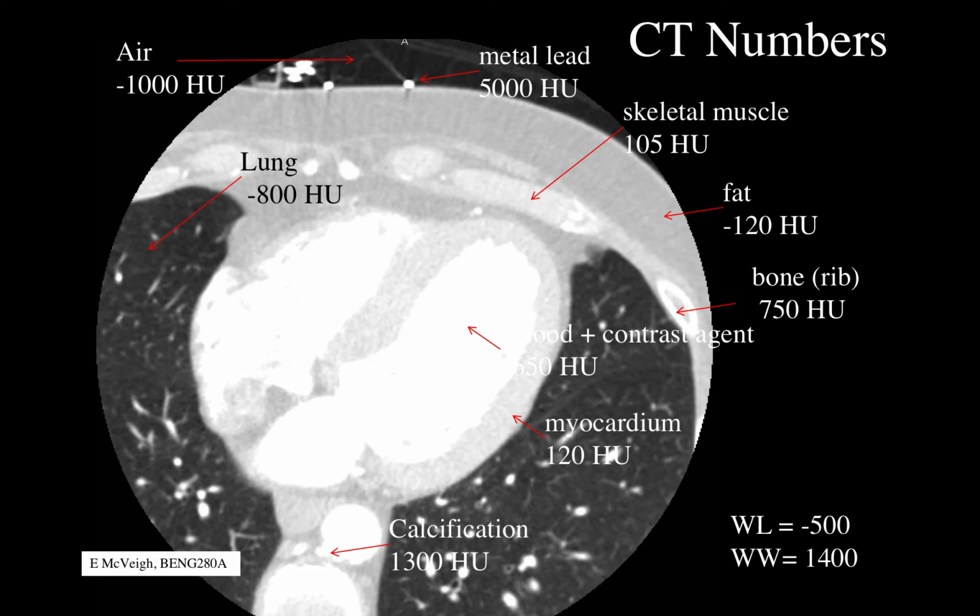Inside that voxel, I've estimated the mu value. And in calcium, you're right, it changes a lot. It depends on the density of the calcium, sometimes on the partial volume, because sometimes calcium can be very small, and so that'll change quite a bit.